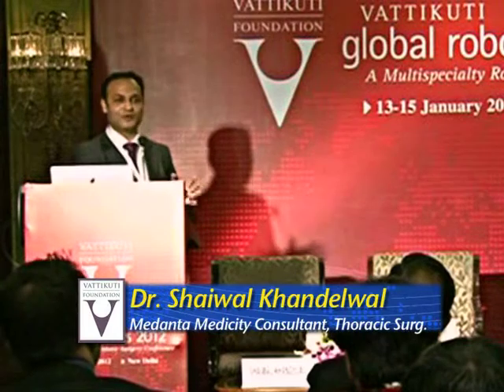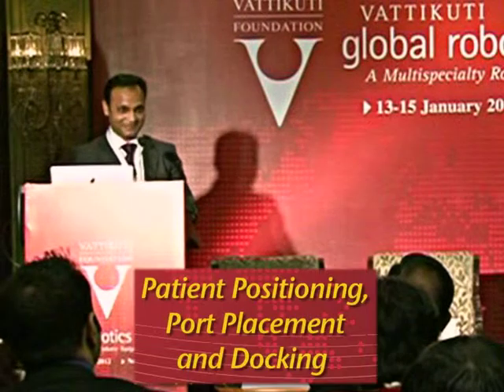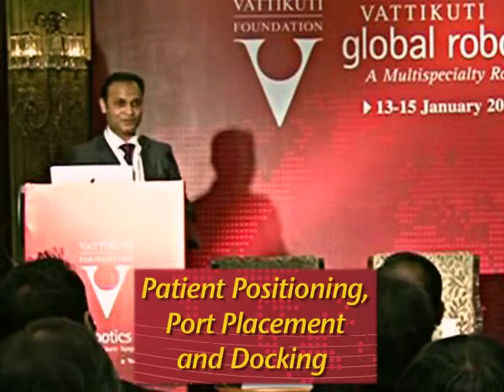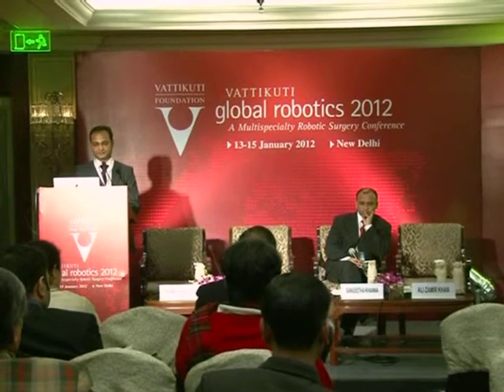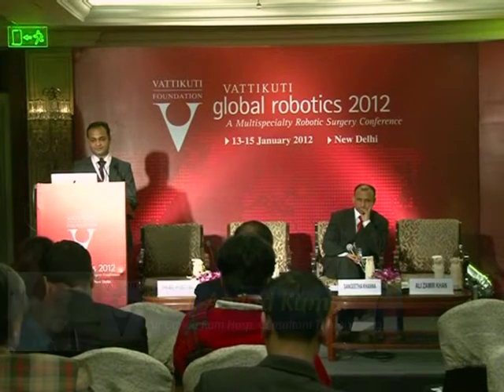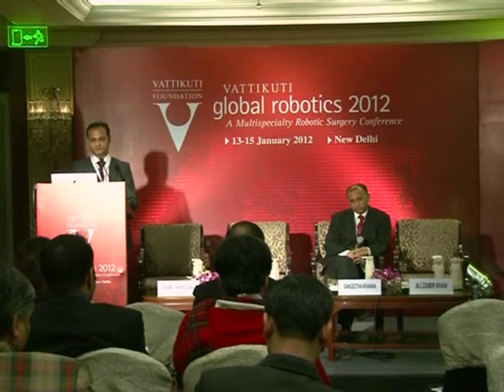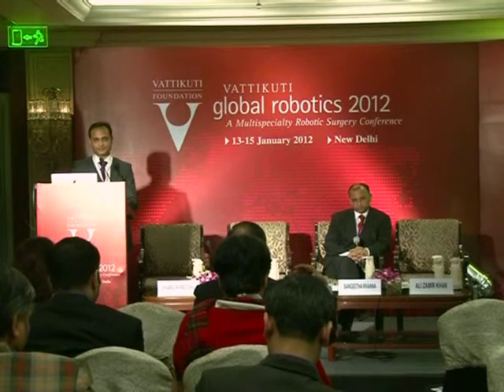The surgeon sitting at the patient side knows what is happening probably at the console, but the surgeon sitting at the console is not aware of what is happening at the patient side. So it is proper communication and understanding between the two that makes the procedure successful. It's not just a trained anesthetist or a trained surgeon. Another trained person is absolutely vital, and as you rightly said, after the anesthetist is done with his or her job, it's your colleague who takes over, decides all the ports, and manages the show while you are away at the console.